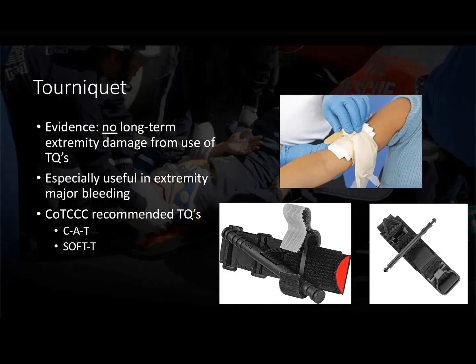Now, you can fashion a tourniquet out of a number of things, including a triangular bandage, and I recommend that you play around with that well before you have patients that need it, because a tourniquet needs to be applied very quickly, and if you're trying to figure it out on scene, it may fail. So that's what we're showing here. It's a manually created tourniquet.